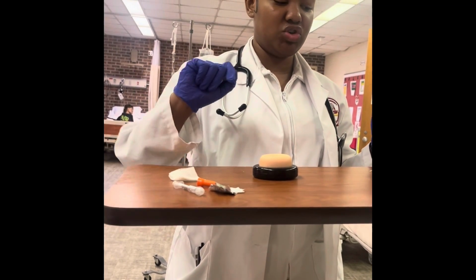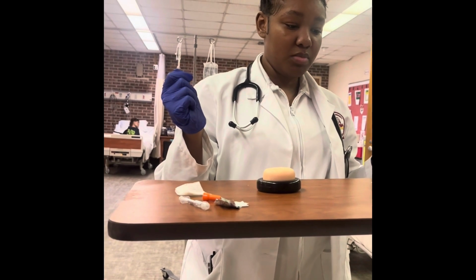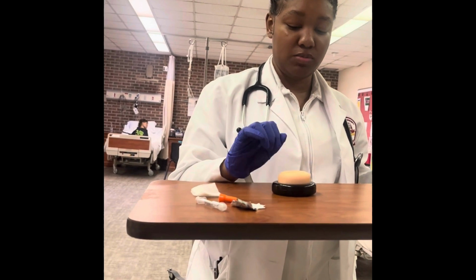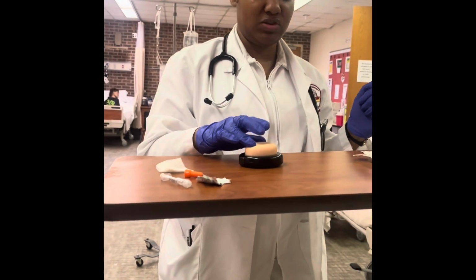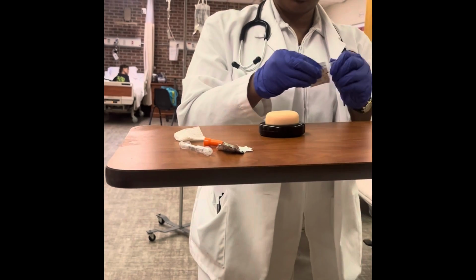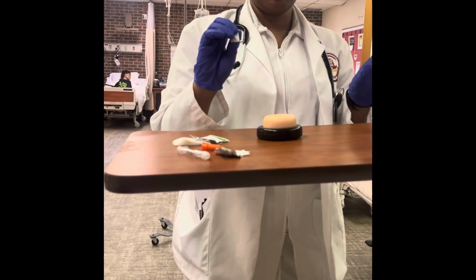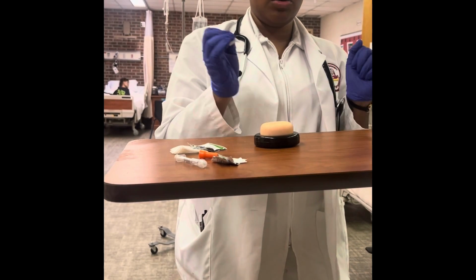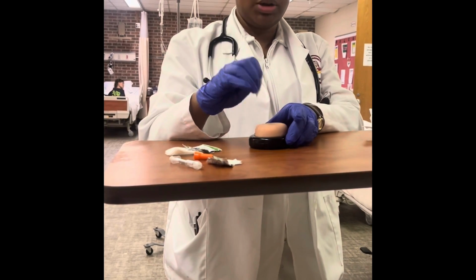And now I'm going to expose your upper arm. I'm going to go ahead and palpate and inspect this site as well. No tenderness. Okay, I see no bruising, signs of infection. I feel no masses or hardness. So now that I got the site identified again. Oh, and all the different types of IM injections are the deltoid, vastus lateralis, and then your dorsal gluteal and your ventral gluteal. But I'm doing the deltoid today.